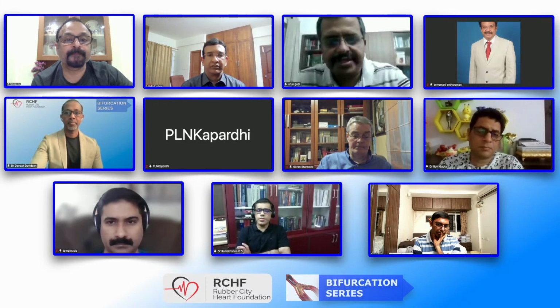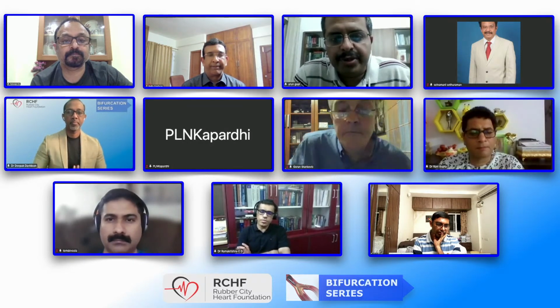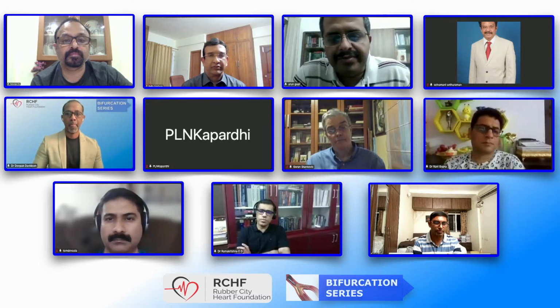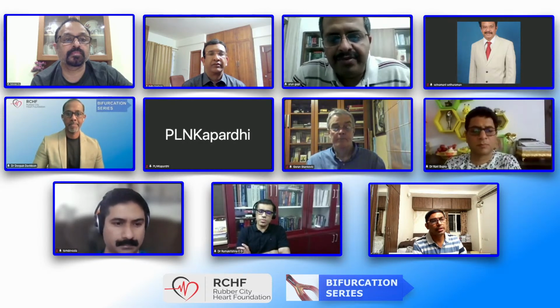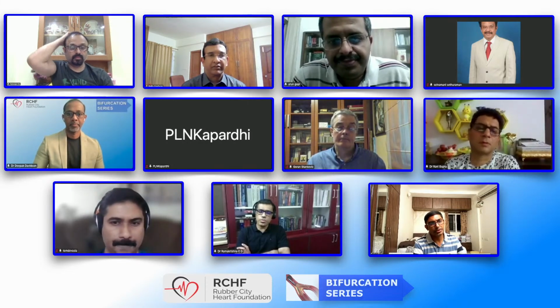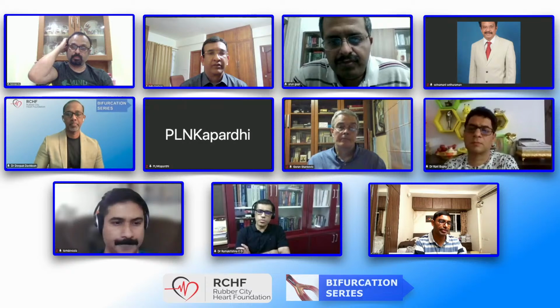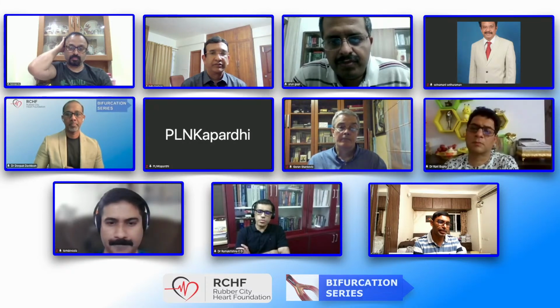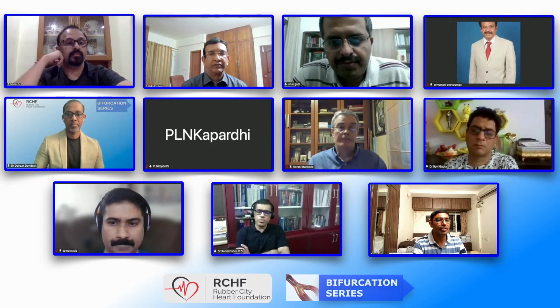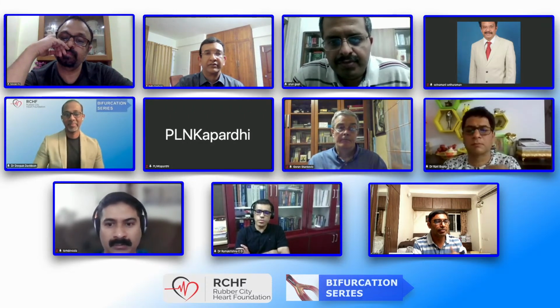Vijay sir, excellent demonstration. Just a question, based on what you showed, do we still have evidence to deal with it with a two-stent strategy just because the OCT area of the ostium of LAD looked less than 4? Is it evidence-based, or would you have been happy to have a physiological assessment as well? Yeah, we could have done that, but this is based on a study from Korea, which has shown that for any left main, it is actually an assessment of the LCX ostium, which has more than 50% plaque burden and an area of exactly 3.7 millimeter square. If you have less than that, highly likely you end up stenting the side branch. That is where your FFR will become positive.